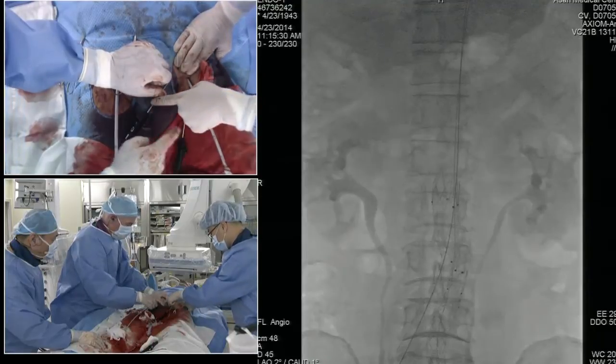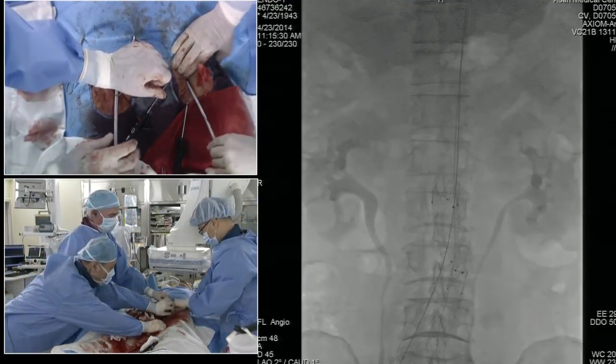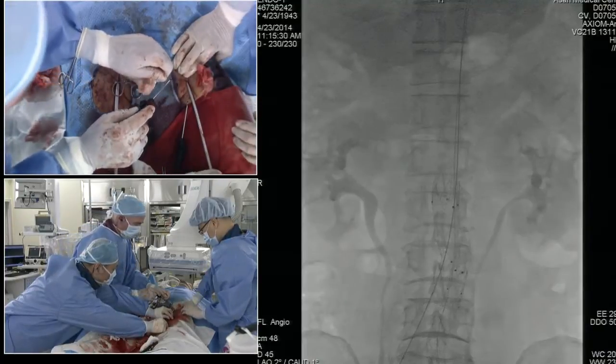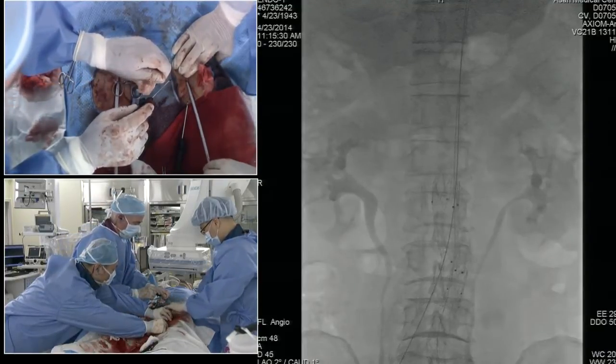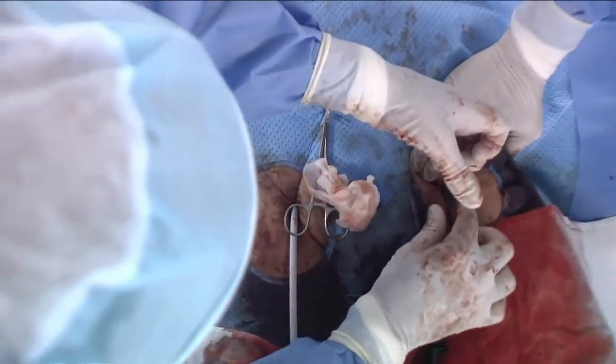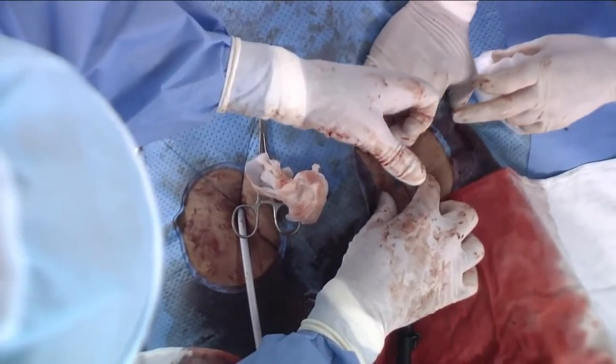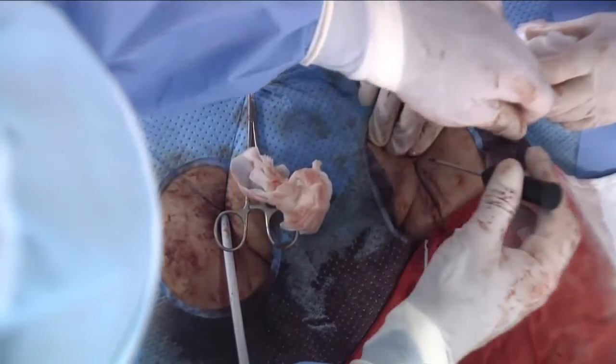We'll take number one. Yes, thanks. So we can come out with the sheath and leave the wire in place. Dr. Hurd's going to take the sheath out. Okay, I slid down the first knot. He's a pretty thin patient, which is good and bad.